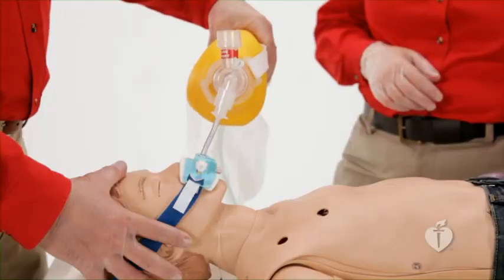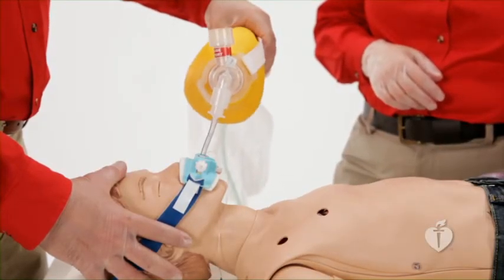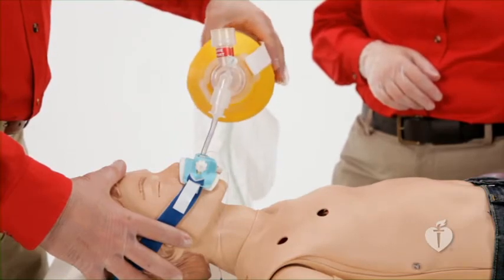Once a child is intubated, verify tube placement at regular intervals and whenever the child is moved or if the child's condition changes. A child with an advanced airway can deteriorate at any time. In these cases, urgent assessment is required. A mnemonic such as DOPE may be useful to troubleshoot causes of acute deterioration of an intubated patient.